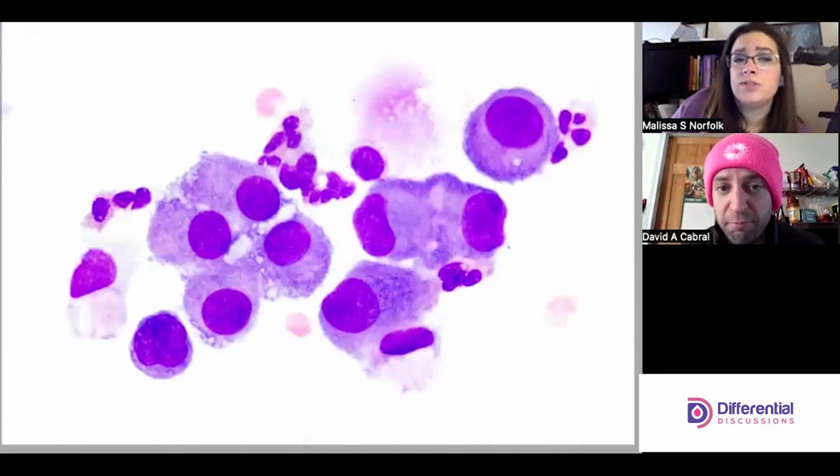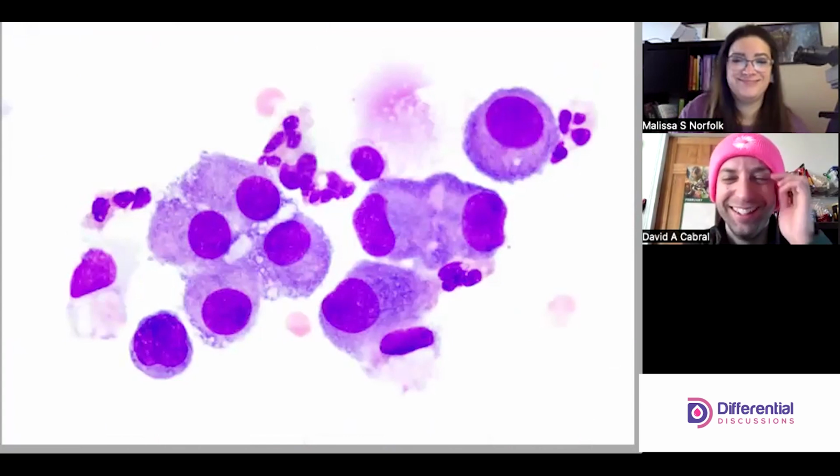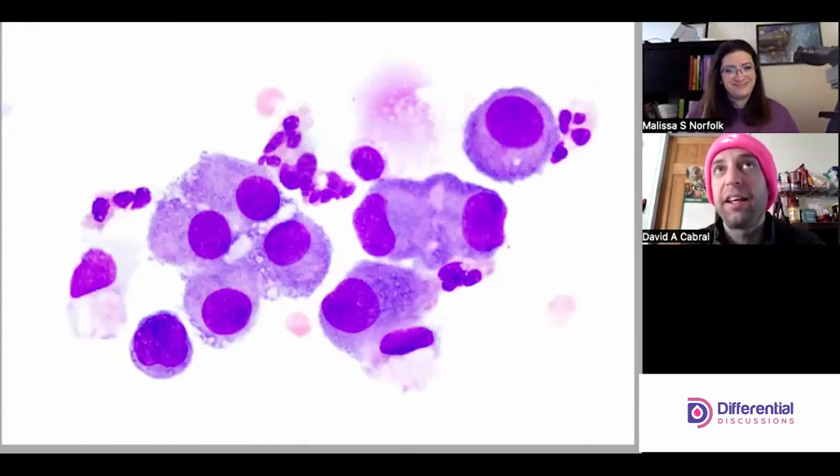So, Dave, I have a question. Why are they not plasma cells, especially this guy up here? I think it's not a bad place for a morphologist to go. Someone who's a student and learning, especially early on in body fluid training, that's not a bad place for your mind to go.